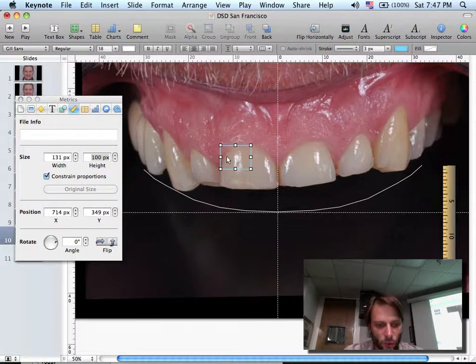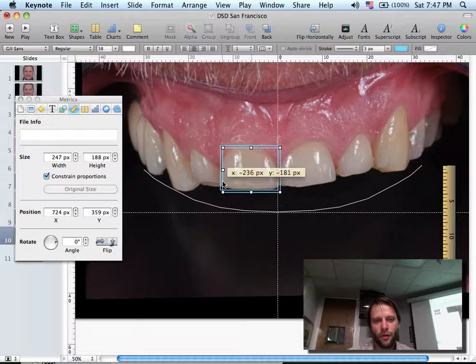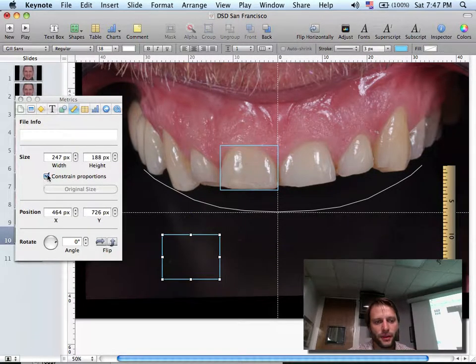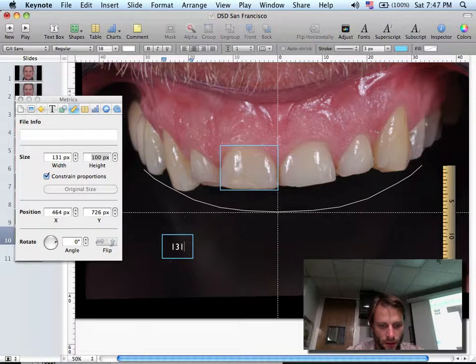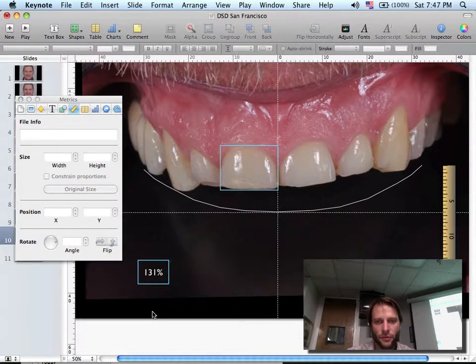So let's make a note here. 131%. How do you write inside the shape? You just have to click on the shape and then type. One step that I forgot to make it easier, before duplicate the rectangle before actually finding out the proportion and writing, so you keep the original one to make the next step over there. So 131% is the actual proportion.